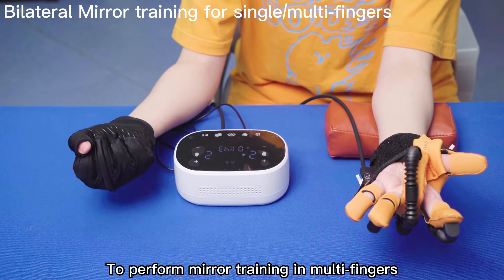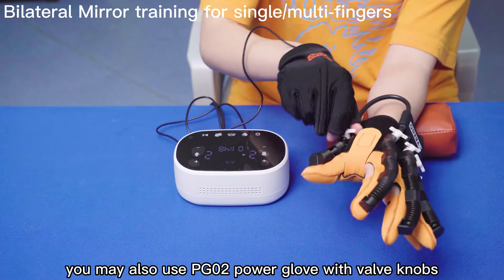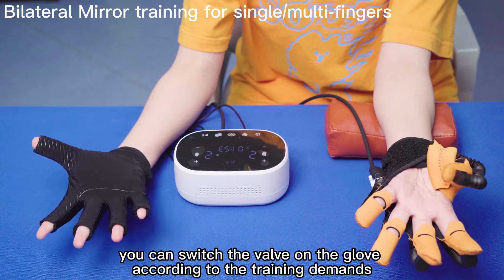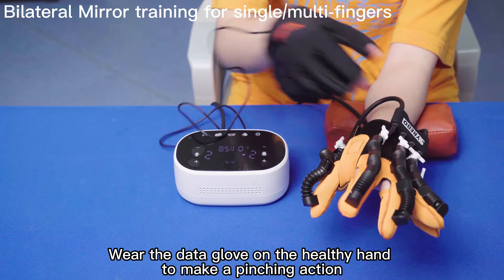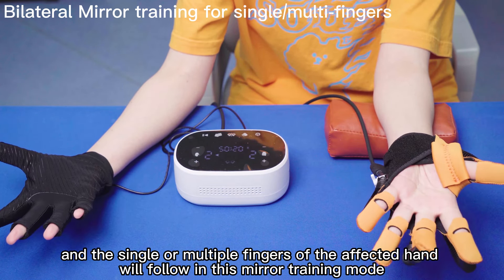To perform mirror training in multi-finger mode, you may also use the PG-02 power glove with valve knobs. You can switch the valve on the glove according to the training demands. Wear the data glove on the healthy hand to make a pinching action, and the single or multiple fingers of the affected hand will follow in mirror training mode.